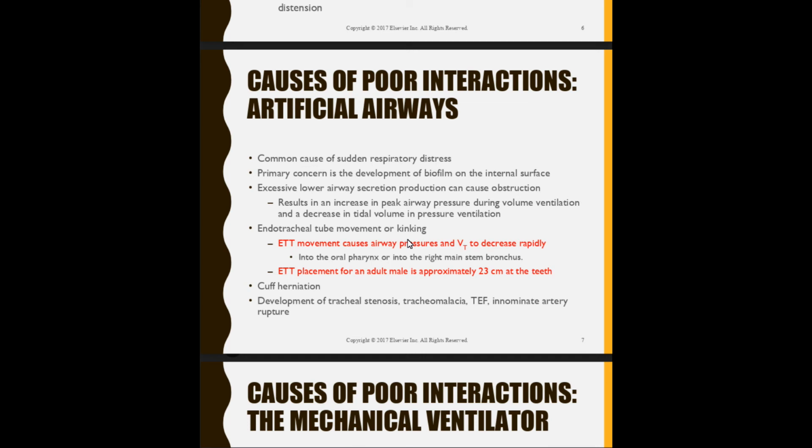around the balloon. And if this biofilm starts leaking down past the balloon, going into the trachea, going down into the lungs, I may have some ventilator-acquired pneumonia, or I might just have some pneumonia. All right, ventilator-acquired pneumonia is actually determined on how long the patient has been on a mechanical ventilator in the hospital.